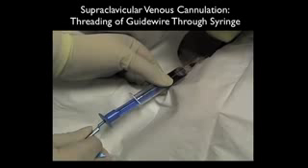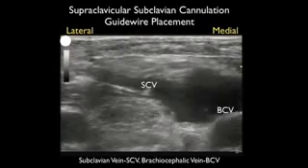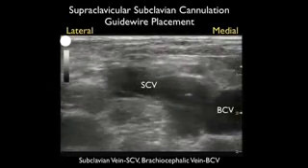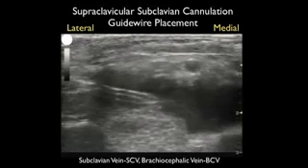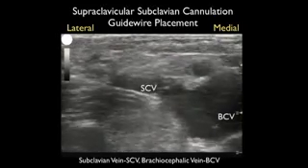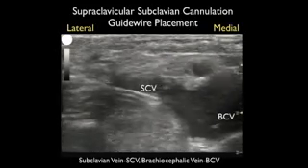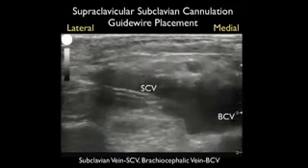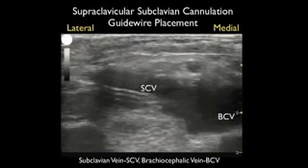Once we've had a successful cannulation, we can guide the guidewire using ultrasound guidance to make sure it passes without obstruction down into the vessel lumen. In this video clip, we can actually see the guidewire advance through the catheter into the subclavian vein laterally, being pushed down into the confluence with the brachiocephalic vein. We can then watch as the guidewire is further advanced down the brachiocephalic vein into the superior vena cava. Remember that we want to position the catheter tip within the superior vena cava so that it doesn't enter into the right atrium.